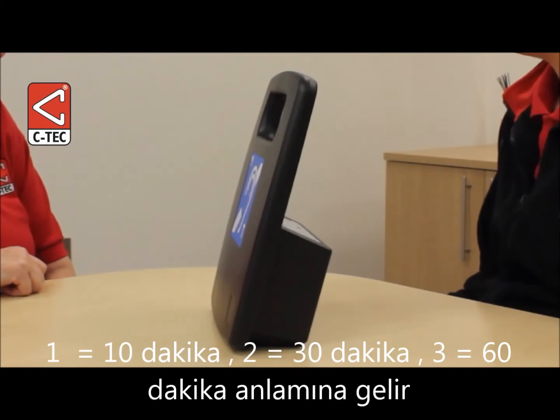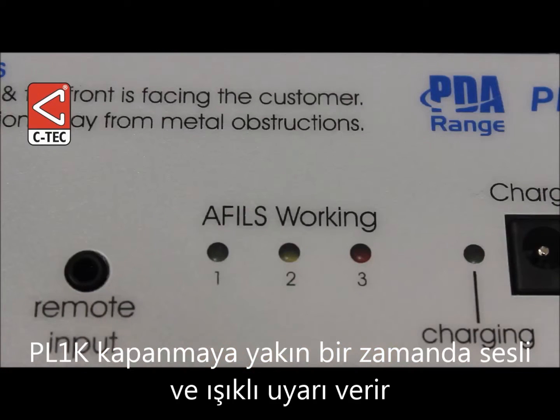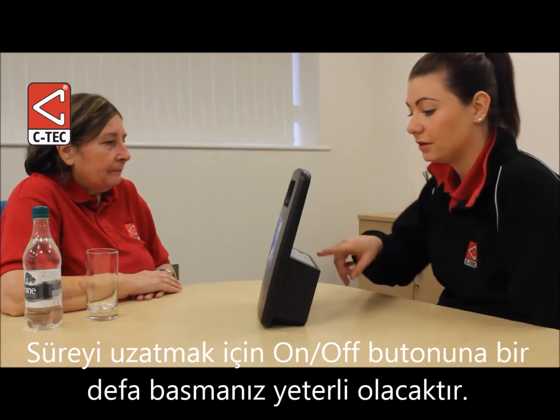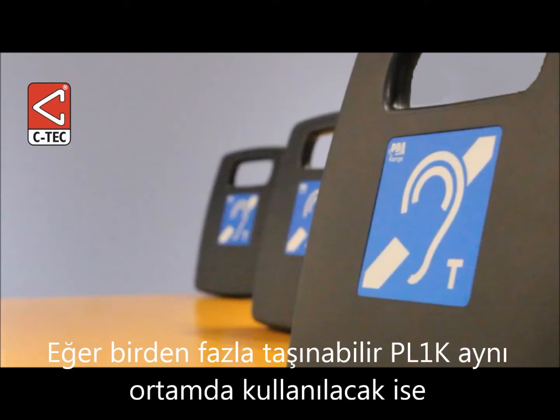The amplifier's on time commences the moment the on/off button is released. 10 seconds before the end of the session, a beep will sound to indicate that shut-off is imminent. To extend this session by a further period, simply press the on/off button again.